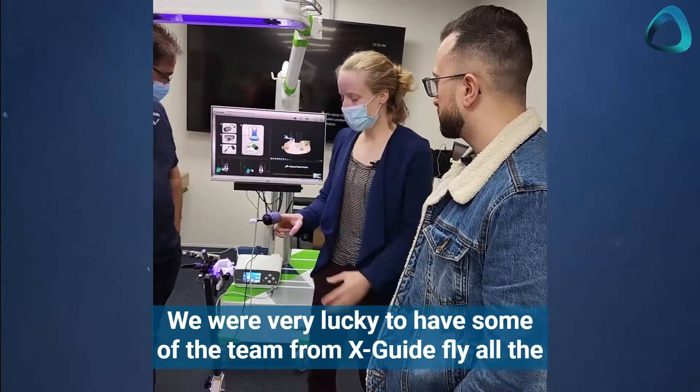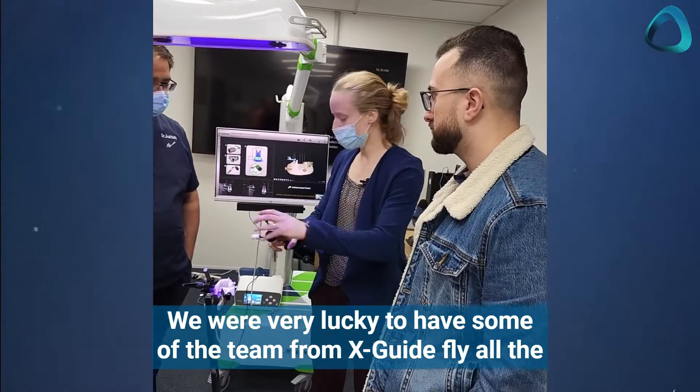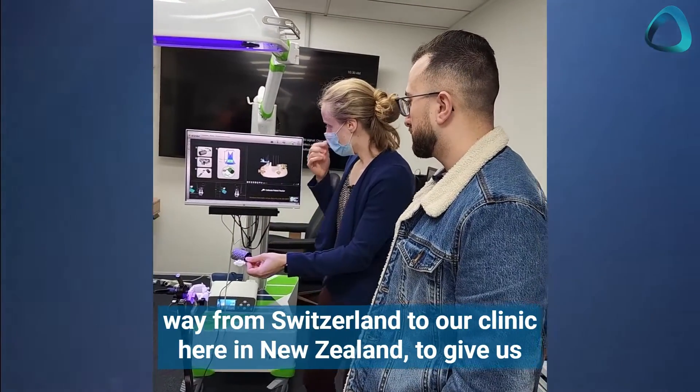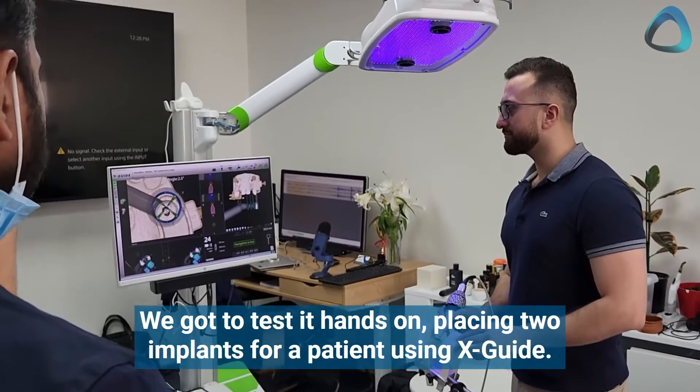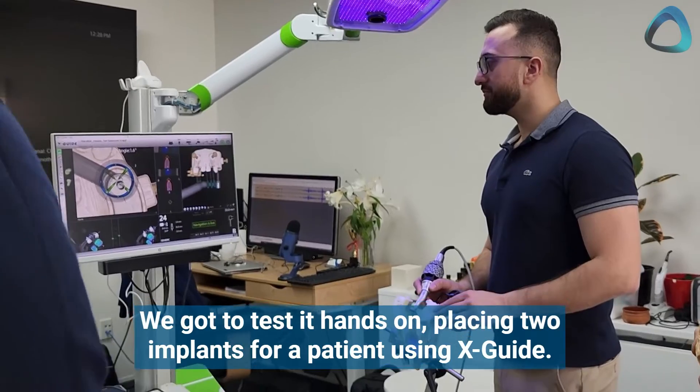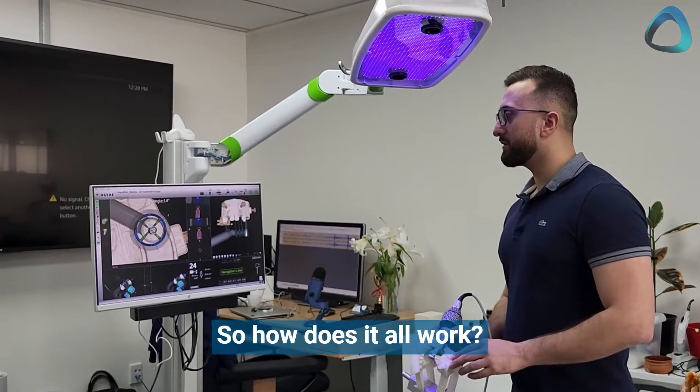We were very lucky to have some of the team from XGuide fly all the way from Switzerland to our clinic here in New Zealand to give us training on how to use the system. We got to test it hands-on, placing two implants for a patient using XGuide. So how does it all work?